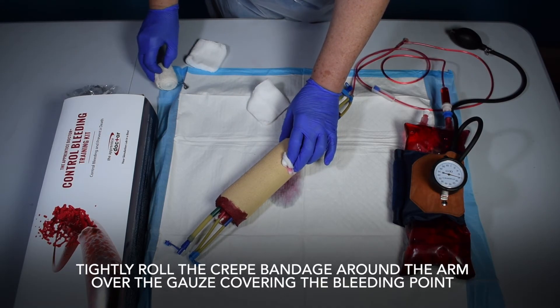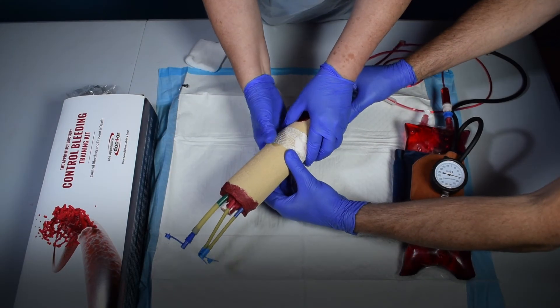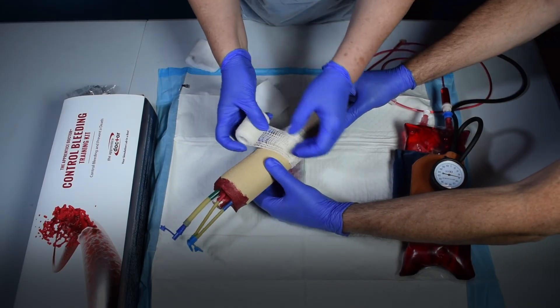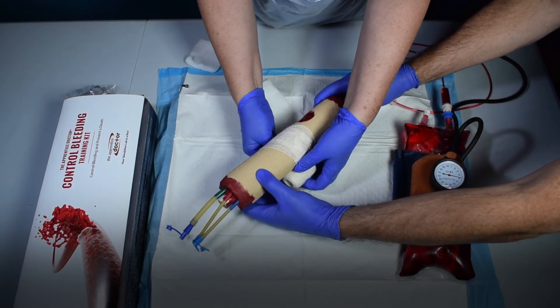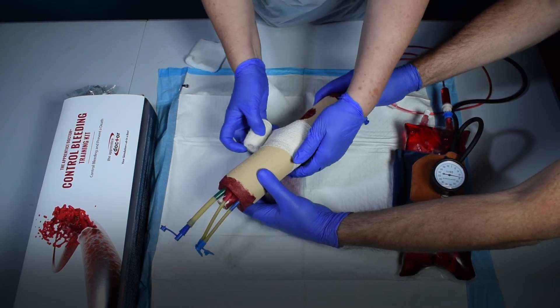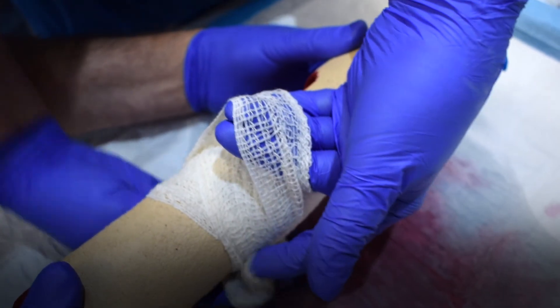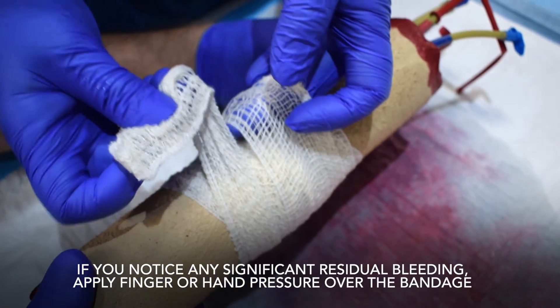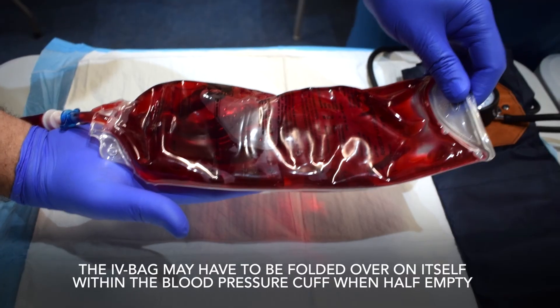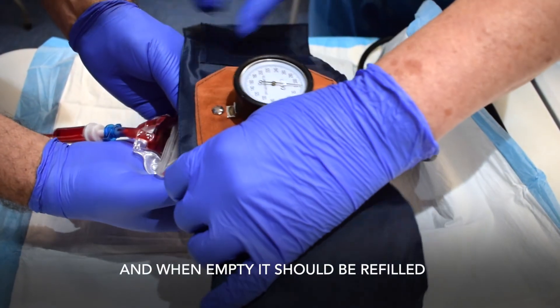Tightly roll the crepe bandage around the arm over the gauze covering the bleeding point. If you notice any significant residual bleeding, apply finger or hand pressure over the bandage. The IV bag may have to be folded over on itself within the blood pressure cuff when half empty, and when empty, it should be refilled.